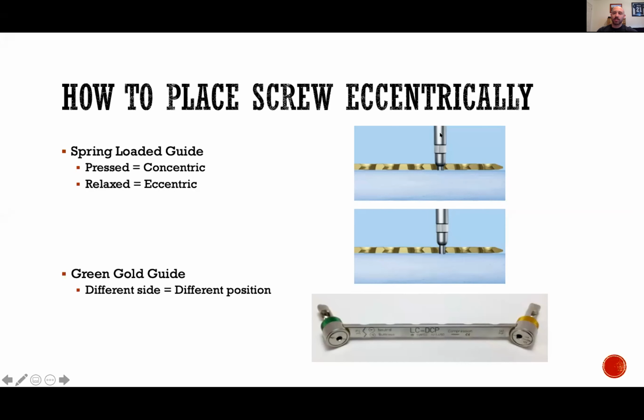Another way is Synthes has this green and gold guide, where one side is for concentric screws and the other side is for eccentric screws.